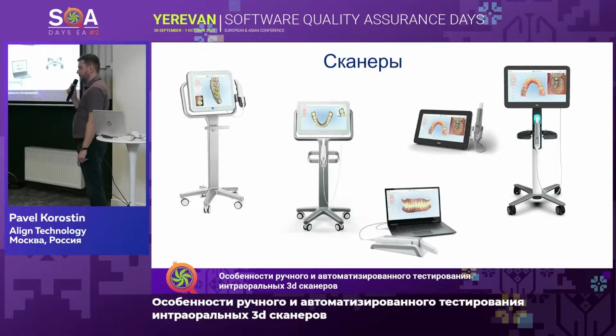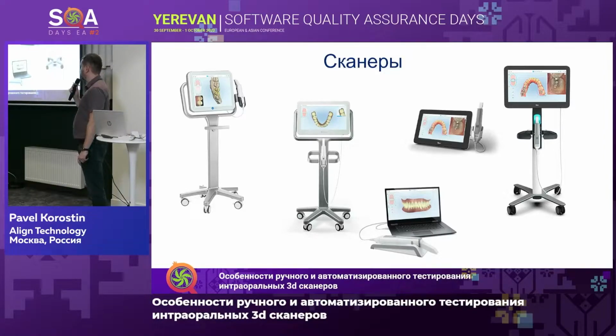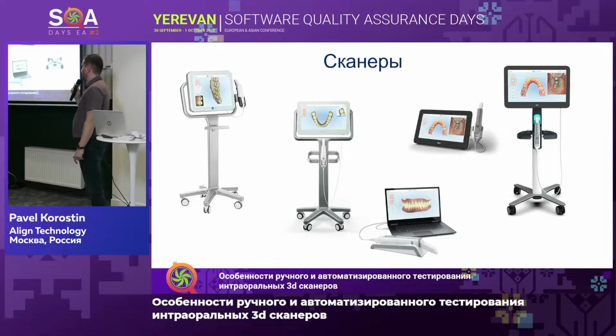One of the areas of use could be restoring your teeth. And they often use it for that. So the company is developing aligners to improve biting mechanics.